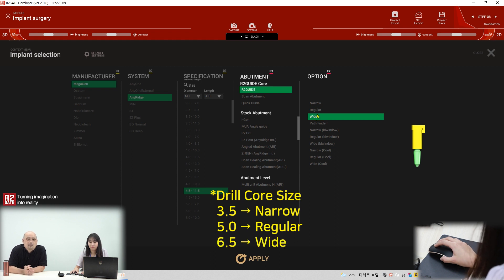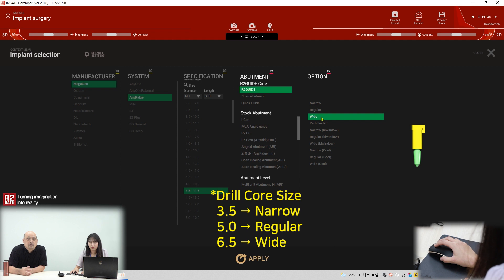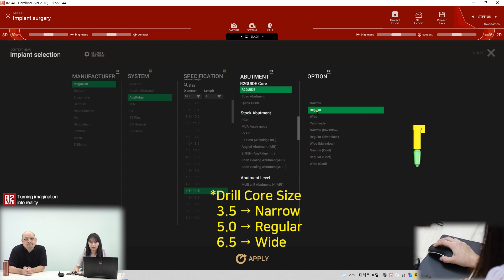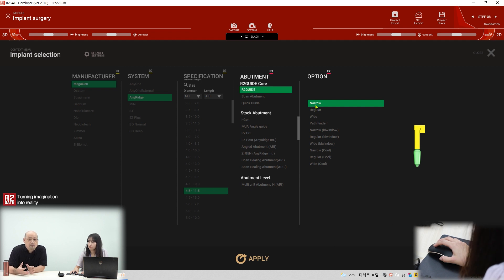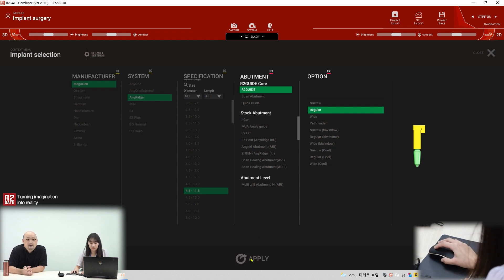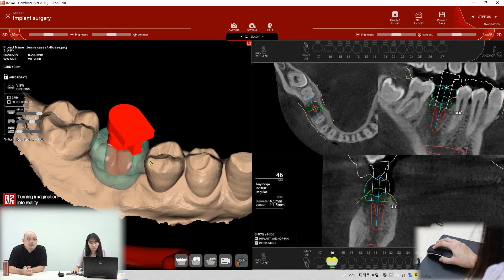The wide core is 6.5mm, for wider implants — for example, diameter 4.5 and above must use the wide core. Under 4.5 diameter we use the regular drill core, and for mini implants we use the small drill core. At this time we are using 4.5 diameter, so we select the regular drill core. Apply — yes, change drill core. Done.